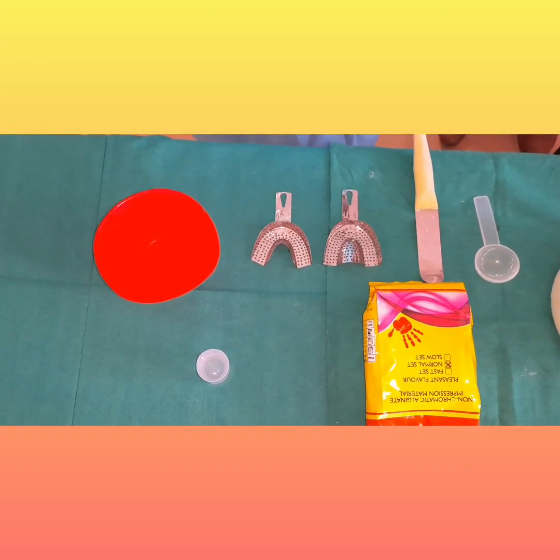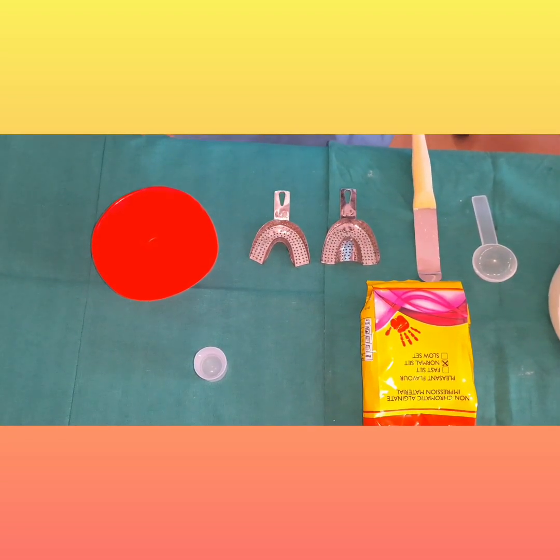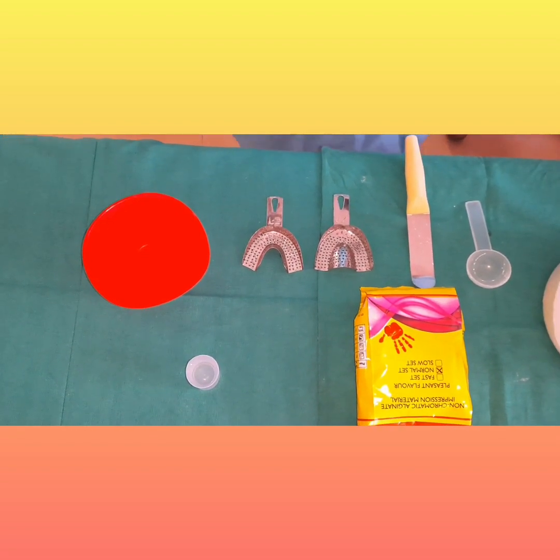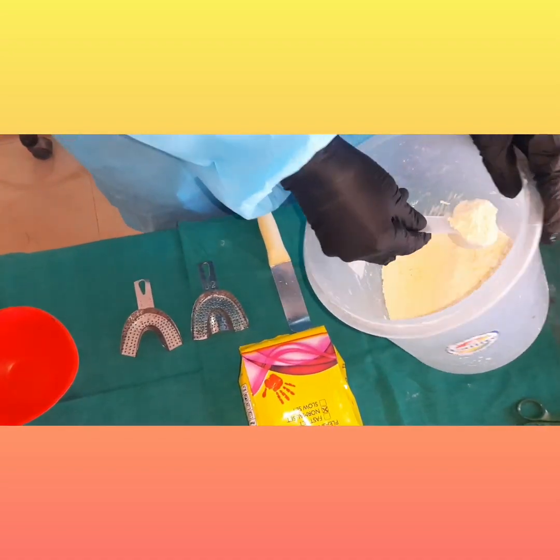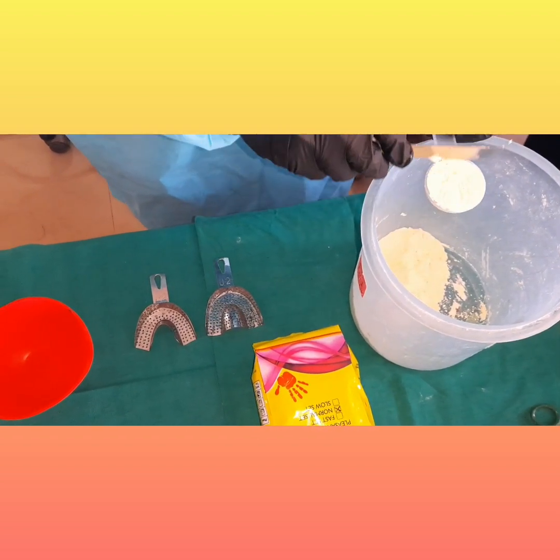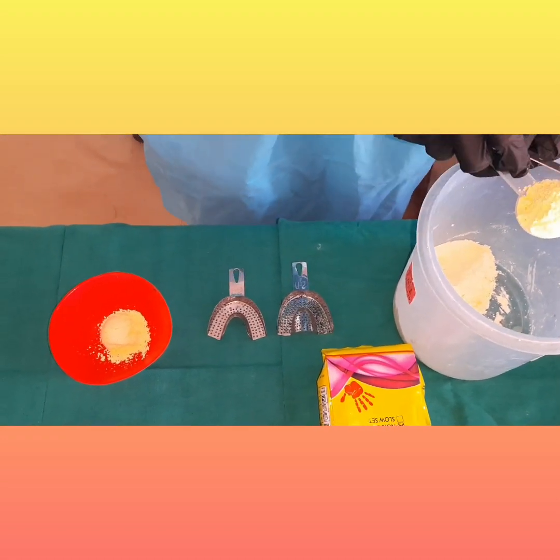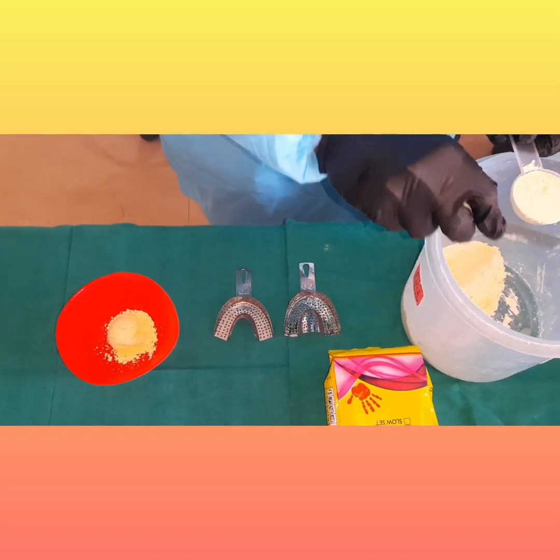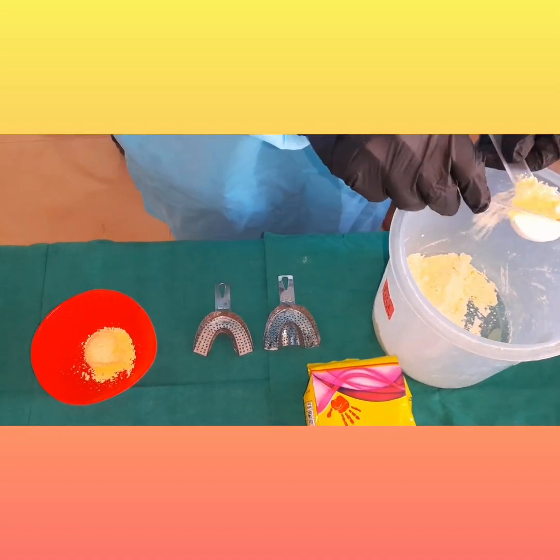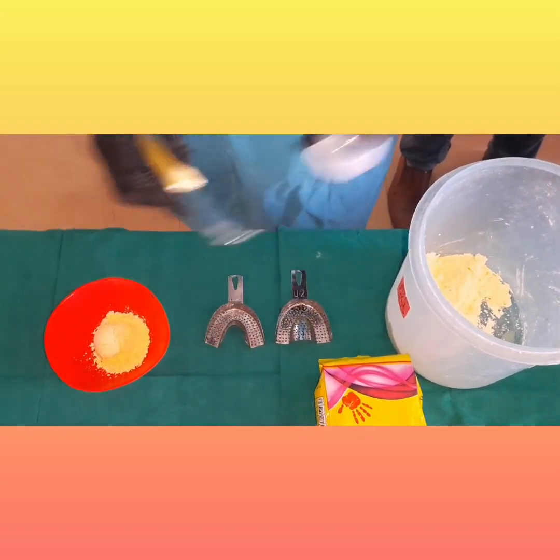I will start with the lower impression. For a lower impression, you will be taking around one and a half to two scoops. Although two scoops is more material for a lower tray, we can discard the remaining material. This is one scoop, and another scoop — two scoops of material.